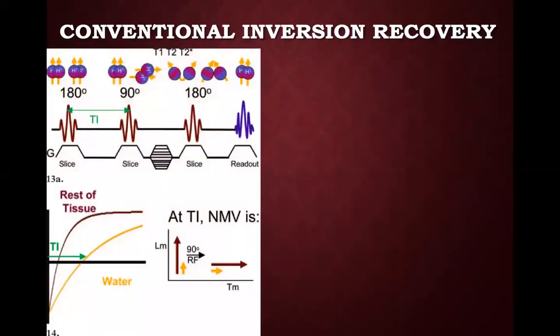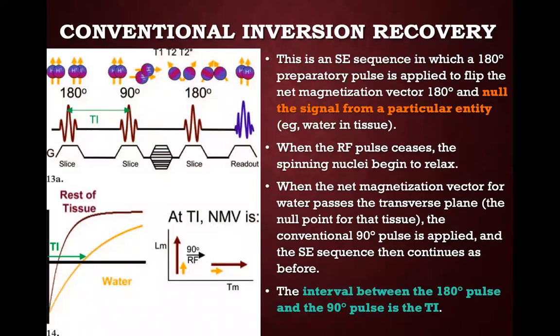You have given the pulse, you have started the race. All the atoms in the body, all the tissues in the body are in alignment, and they are about to produce a signal. When you invert and say that I don't want signal from this, it is like a young boy who says, I don't want to eat dosa for breakfast today. I want only this. So it's like that.